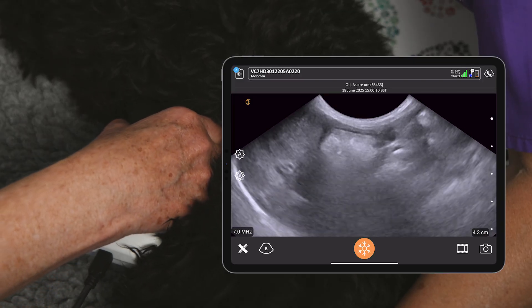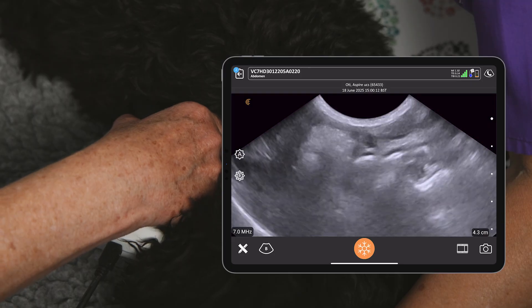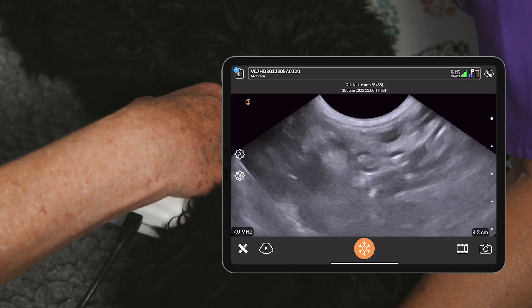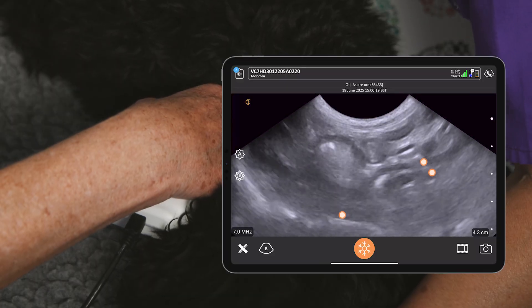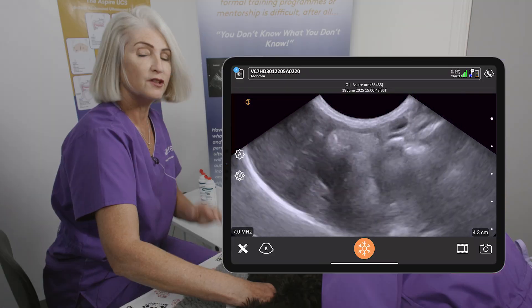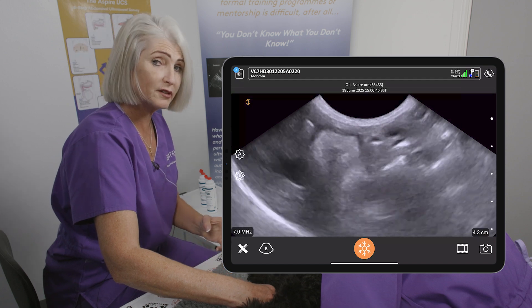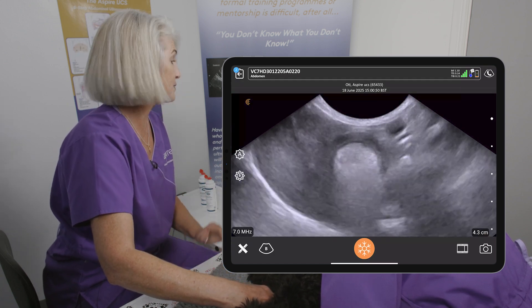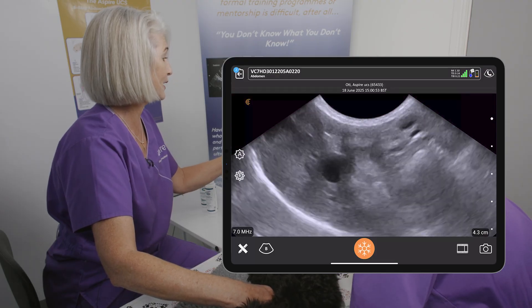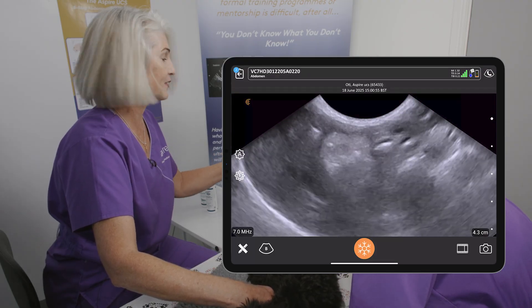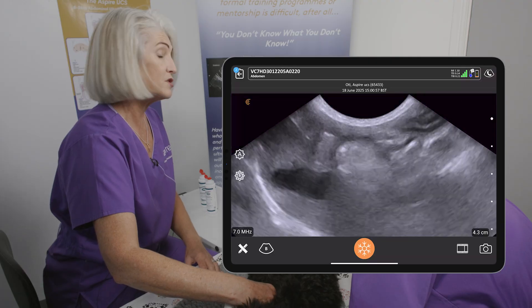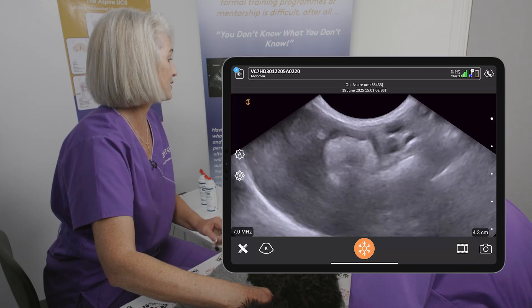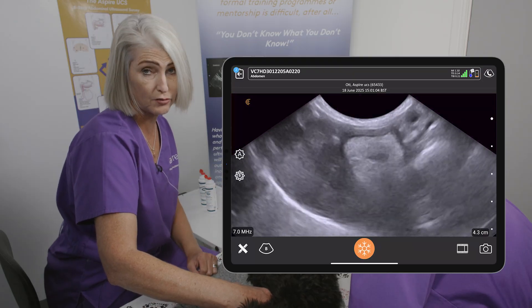Fanning down towards the table is going to take us in the direction of the duodenum and the pylorus, so they'll just start to come in down here. There's a bit of duodenum going down, round the bend and into the stomach. When assessing the stomach, we want to look at the overall thickness of the gastric wall; motility is also helpful — we can see that movement in the stomach, squelching around doing its job. We want to look at those characteristic wall layers of all aspects of the GI tract, especially the stomach and the duodenum.